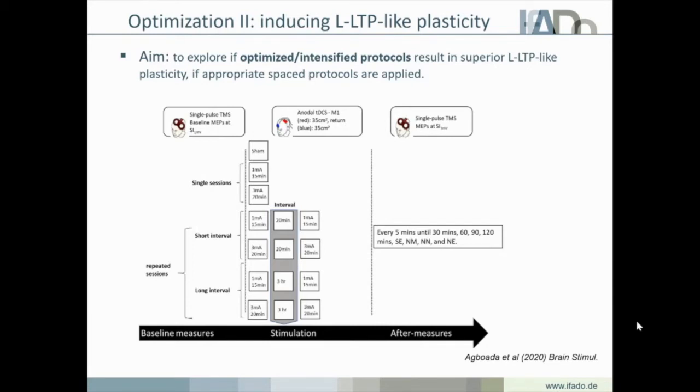So just like the previous experiment I showed, we measured our baseline cortical excitability, applied our intervention, and measured the after effects immediately after stimulation, every 5 minutes up to 30 minutes, every half hour up to 2 hours, same day evening, next day morning, next day noon, and next day evening.